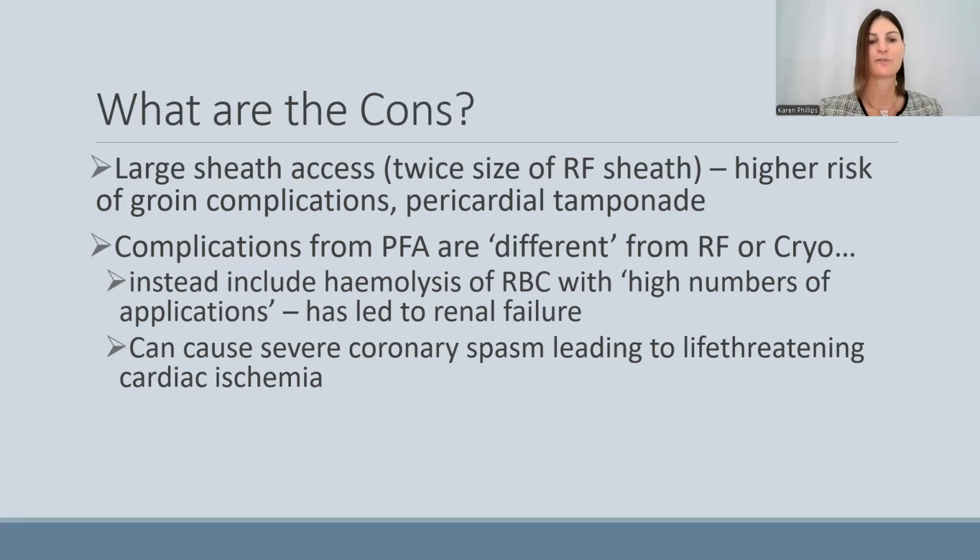The electric field also has a weird effect on the coronary arteries, blood vessels. As I said, it doesn't tend to damage them long term as far as we can tell, but it can lead to acute and quite severe coronary spasm if they're caught up in the electric field. So there are cases where life-threatening cardiac ischemia has resulted from coronary spasm and occlusion, temporary occlusion of the coronary arteries during ablation treatment.